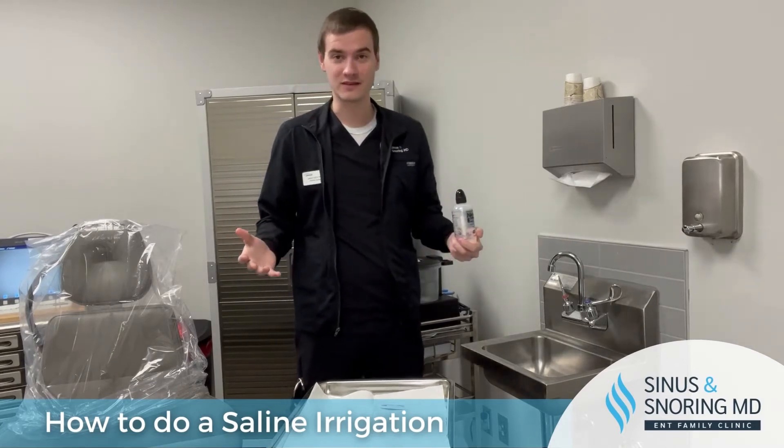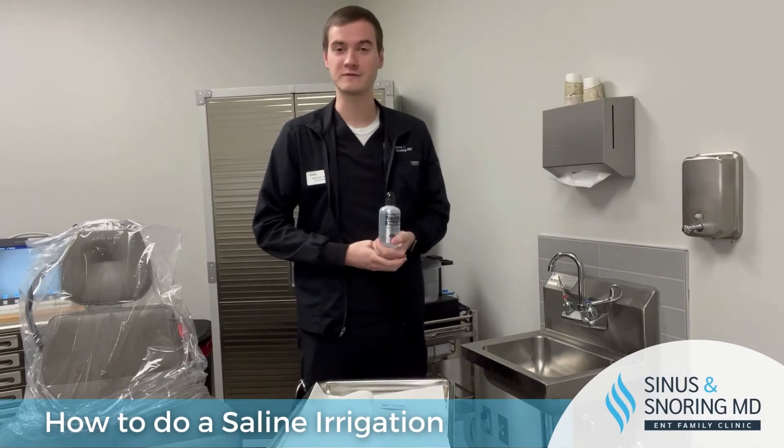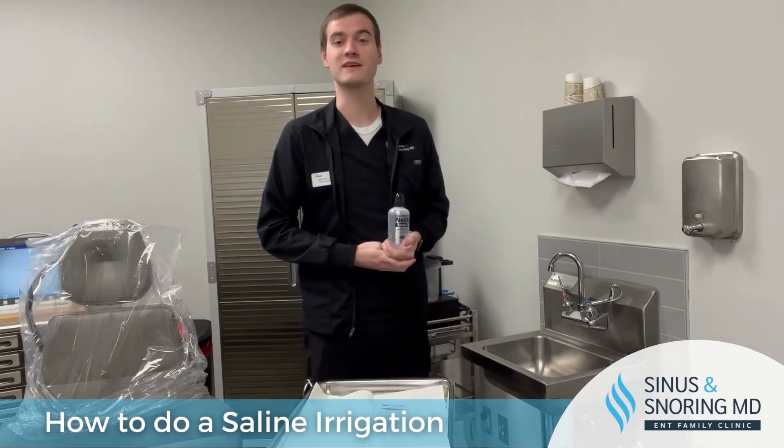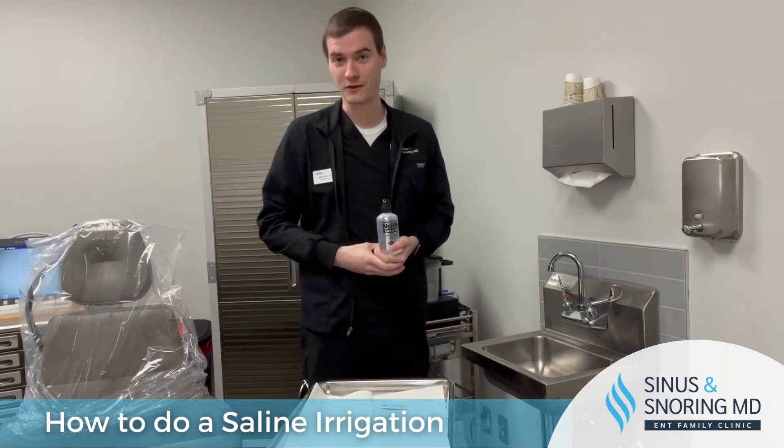For those who have never done nasal irrigation, it can be very odd and potentially uncomfortable the first couple times, but in almost every case it does start to actually feel good as you moisturize and move the crusting through your nose.